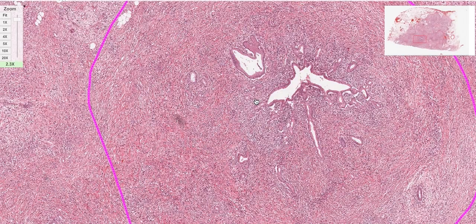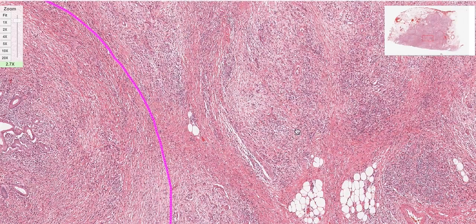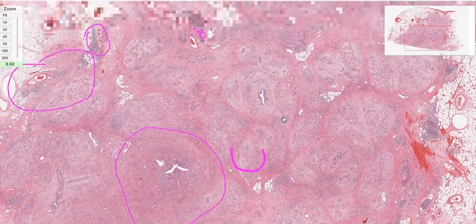This is not the case in a hepatic or liver cirrhosis. It will be seen only in the border. Here you can see it anywhere. Anywhere if you see the fibrosis, it goes into the tissue. The fibrous septa from the periphery is going to go into the tissue. This pattern of fibrosis, I call it storiform fibrosis, right? It looks like the spokes of a wheel. It's just an imagination, right?